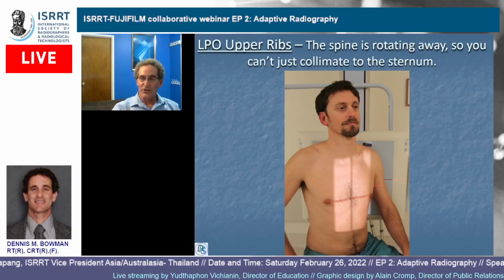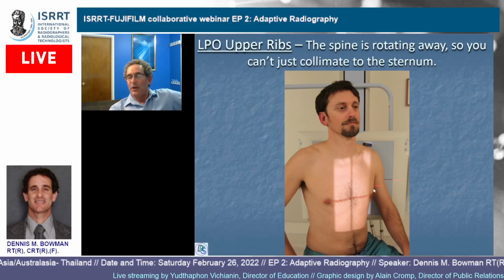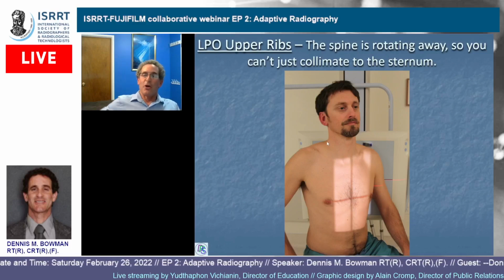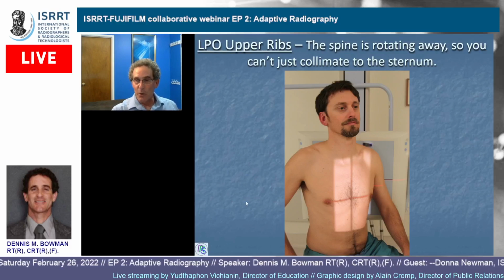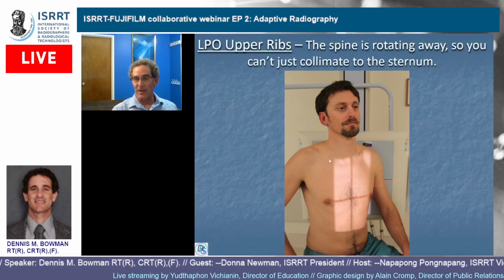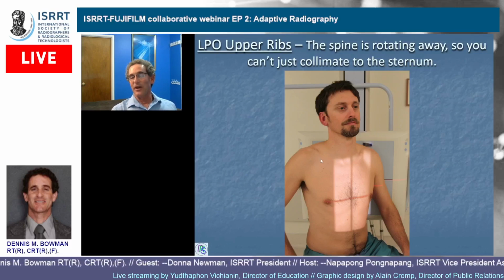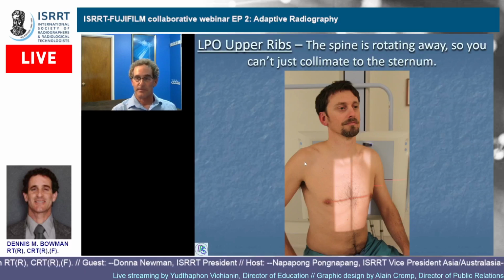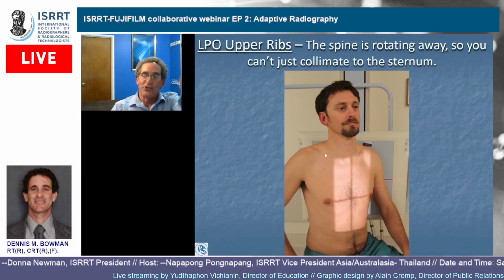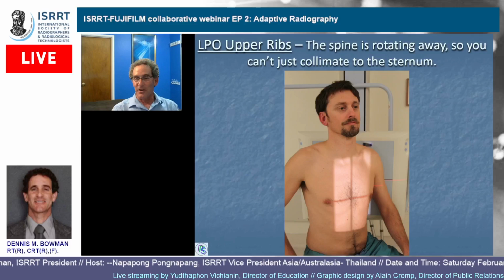And you can't just go from sternum to the outermost part of the ribs, because a rib cage is sternum all the way to spine, right? So you have to imagine where is their spine. And then this light field has to, by the time it diverges, it has to be there. That's the perfect shot: you have to get the spine on, and you'd love to not get anything more than the spine on. So in a way, you're sort of guessing it, of how thick are they, how much divergence is going through them to get to the perfect spine back there.